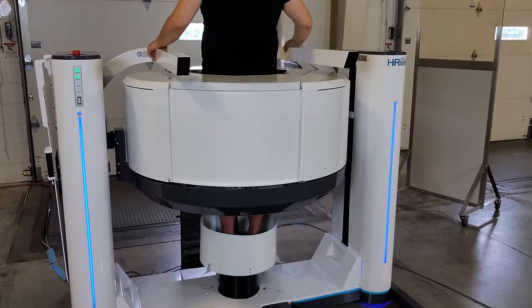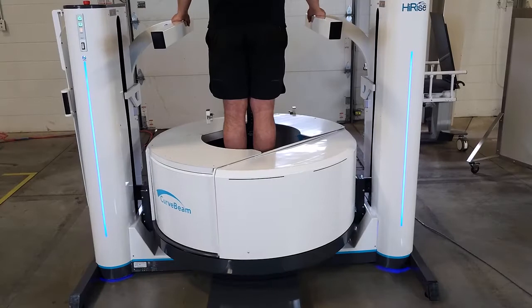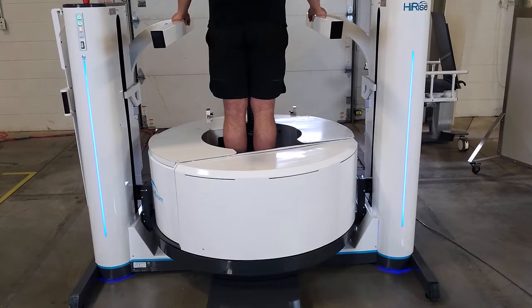The gantry then lowers to the knee position and rotates to capture a second volume, then down to the foot position to capture the last volume.